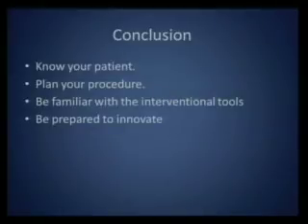The other day I was at cardiology, last Thursday, not this Thursday, before that, they called me for an axillary stenting and they did not have a long enough sheath. So they started the case. Now they have access, but they don't have the right sheath. It took them 20 minutes to find the right sheath from vascular surgery. So know your tools, know exactly what size sheath, what guidewire you want, through what sheath the stent will go, through what sheath the balloon will go, before you start a case.